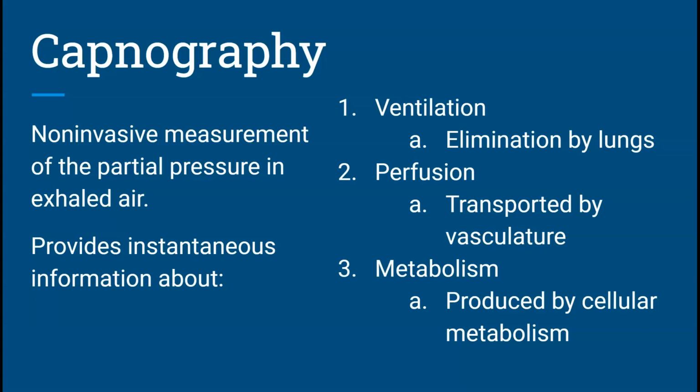The whole idea behind capnography is that it gives you a non-invasive measurement for how much carbon dioxide is in the exhaled air, right? The partial pressure. So we talked about the rules of partial pressure previously in the last class, and nitrogen is your number one component of air. 21% is your oxygen in regular breathing air. Carbon dioxide, your body produces it, and then you can get a good measurement with it from capnography.